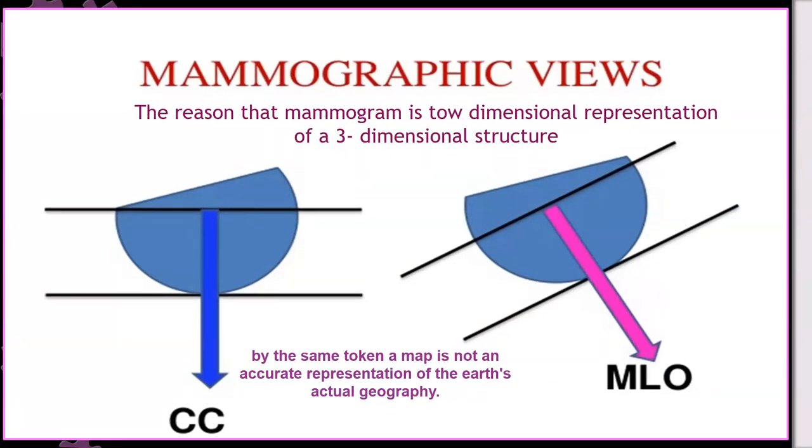And why is mammography performed in two views? Why is a single view not enough? Why is it recommended to have two views, MLO and CC? To cover an area not covered by one view, like the axillary area not covered by the CC view. Also, there is something like focal asymmetry pathology: we see it in one view and miss it in the other view. So two views help characterize lesions of the breast.